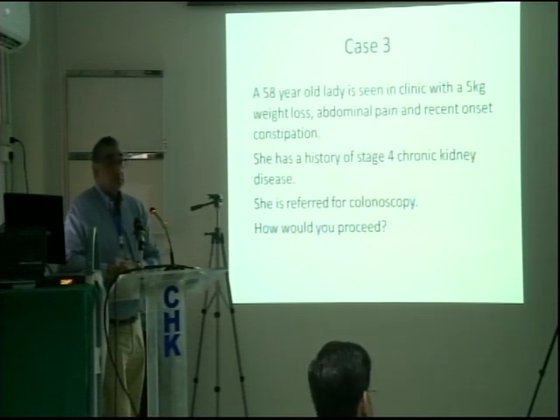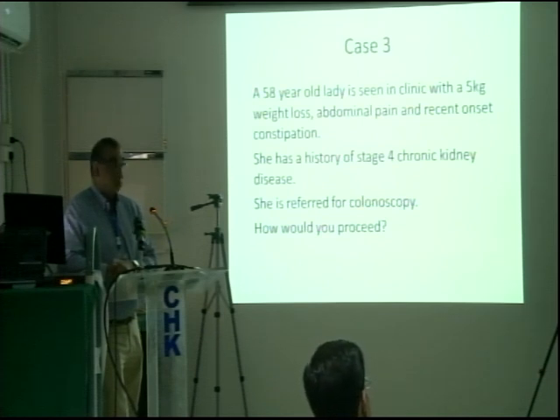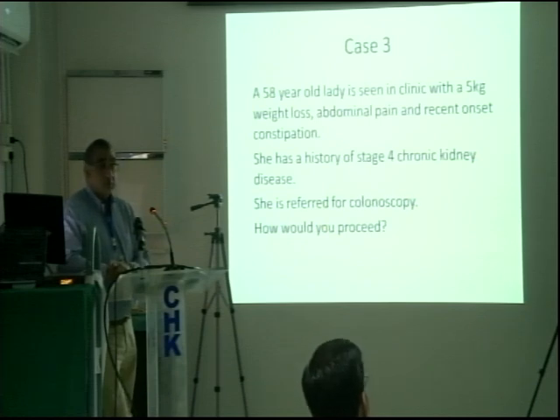If you don't understand, then if you lose 1-to-1, which they must have explained, if 1-to-1 is being missed or your scope is at 90 or 100 centimeter, you have a loop. No matter how straight, no matter what you're doing, you have a loop. Okay? So when you're doing GA, please be careful. Best not done, but if you're going to do it, sometimes you have to just be a little bit more careful.